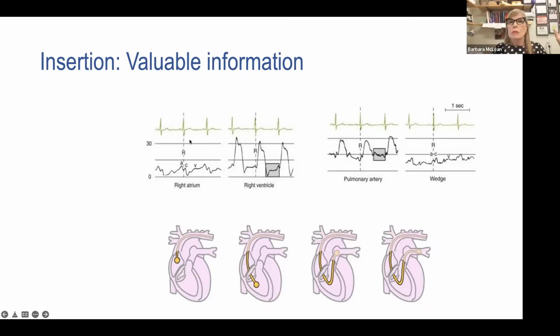So right atrial, CVP, and wedge, which reflects left atrial, are non-pulsatile pressures. They have small waveforms that basically reflect the difference in pressure as the atria contracts, as the valve closes, as the valve bulges into the atria. Those are known as A wave, C wave, and V wave, but they are designed to be non-pulsatile. Doesn't mean that you might not see a pulsatile pressure.